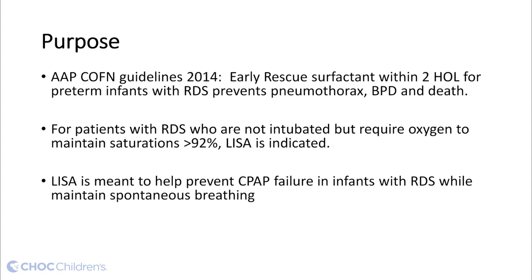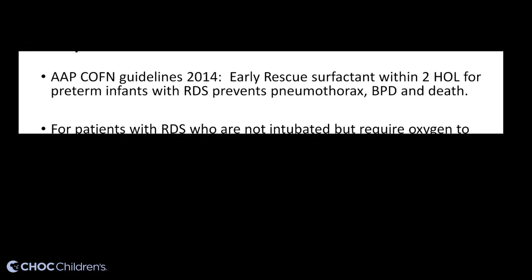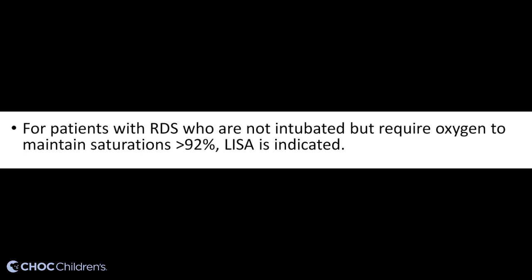Before we start, let's talk about the purpose and indications for LISA. Purpose. Research supports surfactant administration within 2 hours of life for intubated patients in the delivery room or as soon as possible after intubation in the NICU. For patients with respiratory distress syndrome who are not intubated, for instance babies on CPAP, but require oxygen to maintain saturations greater than 92%, LISA is indicated.